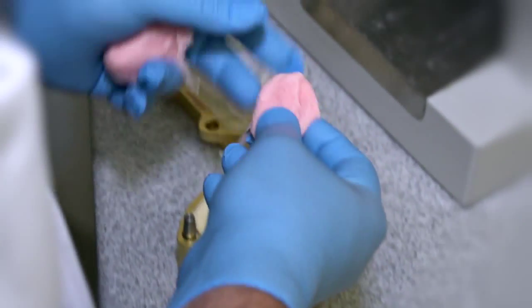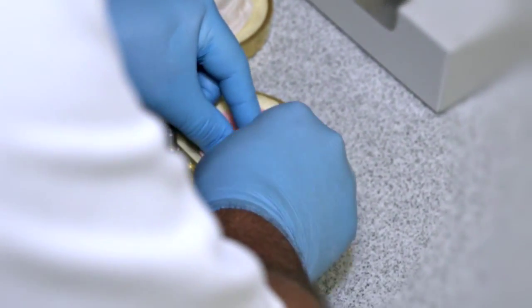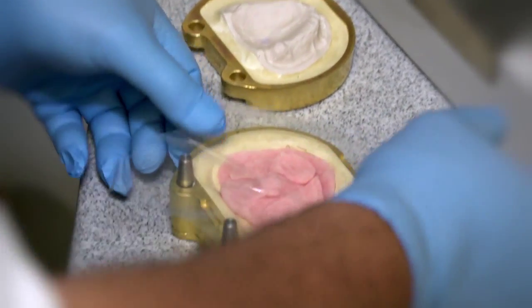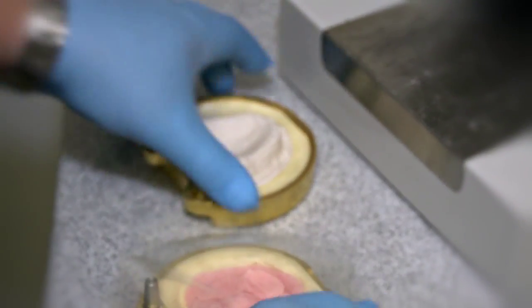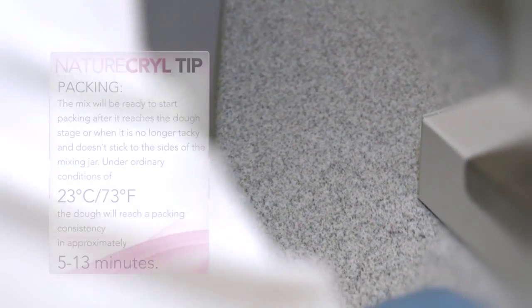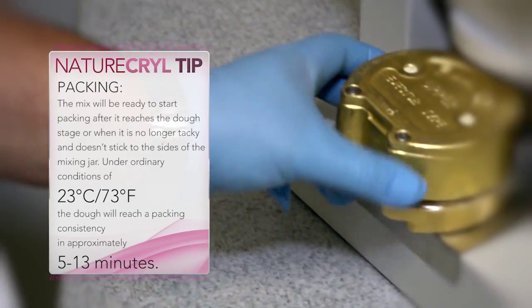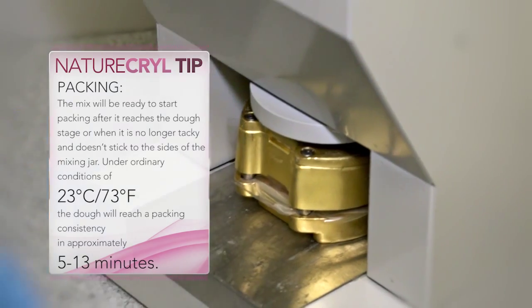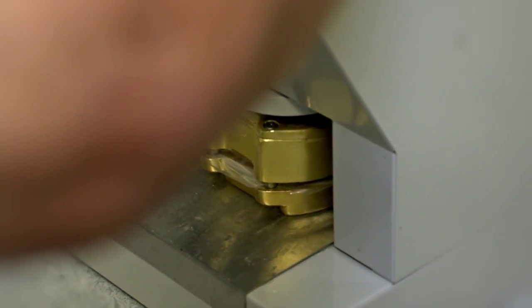Take a little bit. Take a plastic sheet. Another plastic sheet I always use too. This is the first trial pack. Close it together. Turn it over. Put it in the Nevin processor. Press buttons number 1.